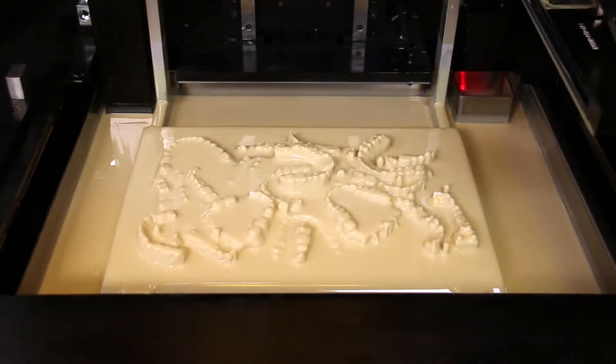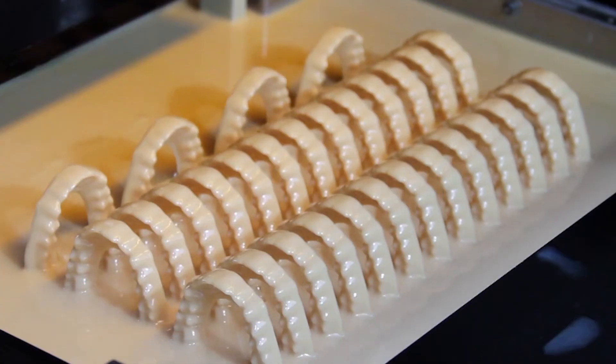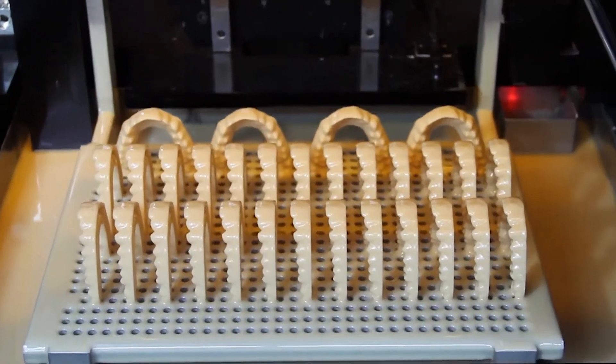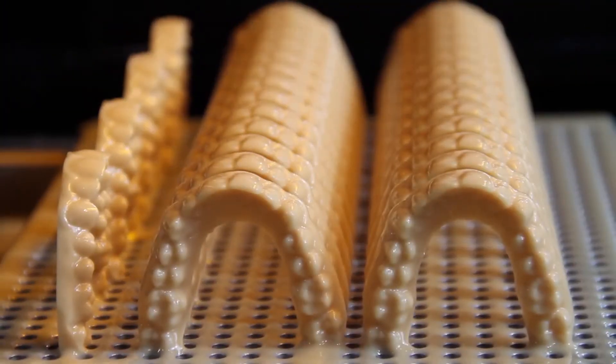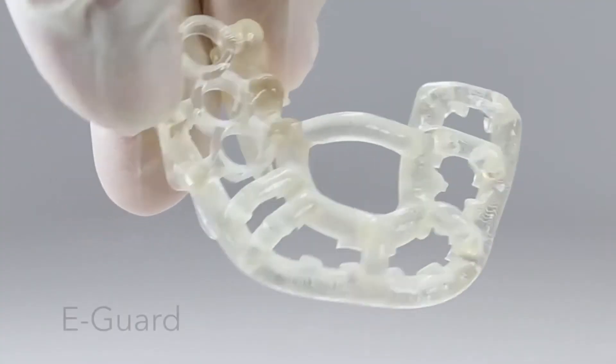We use the e-model light resin for our models. I think Ambigentech model printing is the best in the current market compared to any other 3D printer company out there. The reason being is the density of the solid model — it's much stronger and has a very smooth finish. We have used a few other leading brand 3D printers in the past, but none of them have had the material delivery and applicability that Ambigentech had with their FDA approved materials.